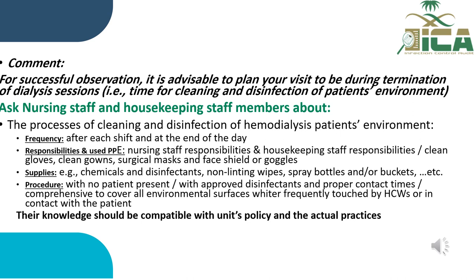For supplies, for example, chemicals and disinfectant, non-linting wipes, spray bottle, and buckets. Procedures: with no patient presence, with approved disinfectant and proper contact time. Comprehensive, to cover all environmental surfaces, frequently touched by healthcare workers or in contact with the patient.